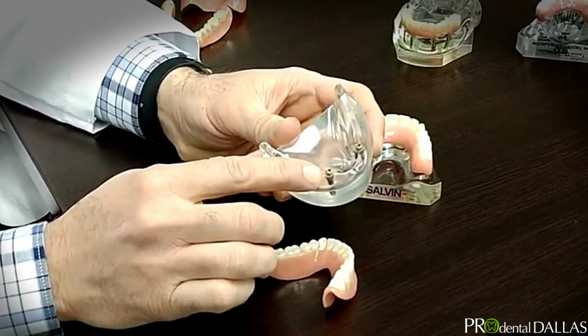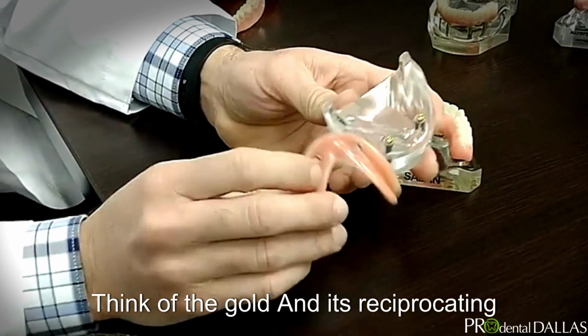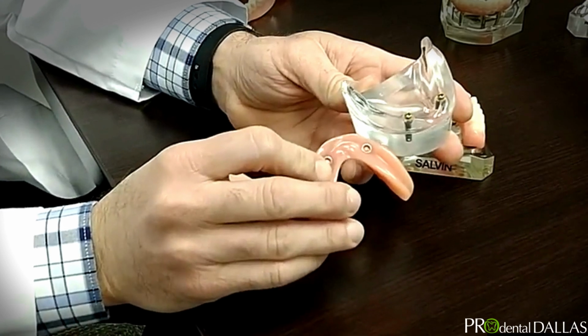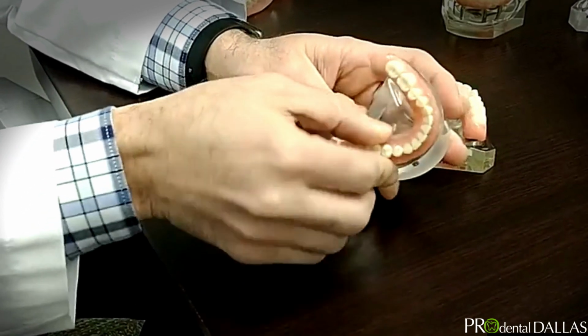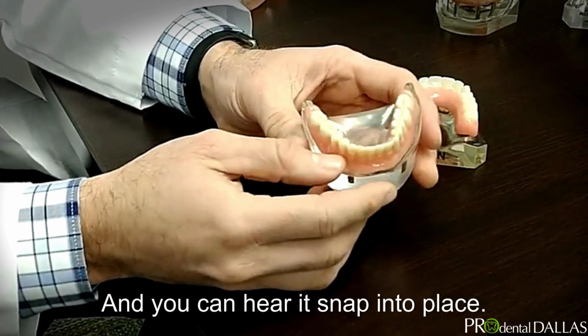And on top of that, an abutment is placed. That's the gold piece that you see here. Think of the gold and its reciprocating part as being a button. And that's essentially what it is. It allows the denture to snap onto the implants. And you can hear it snap into place.